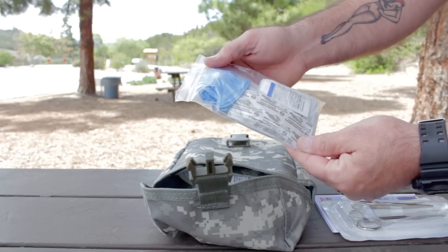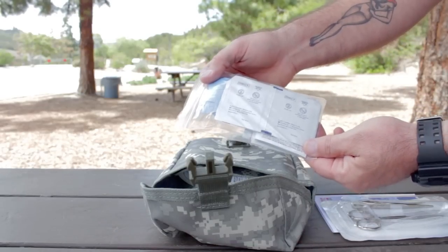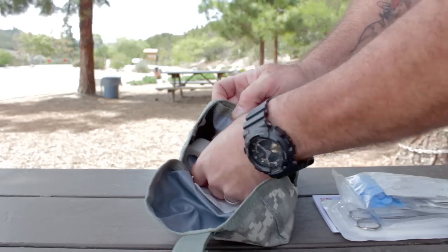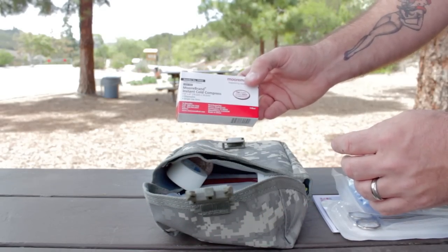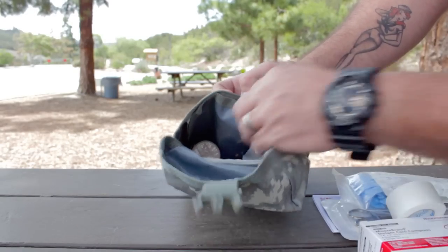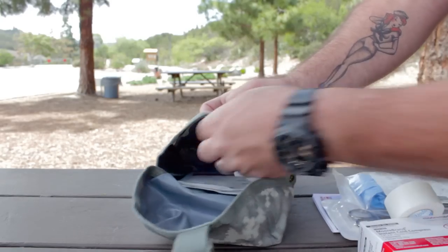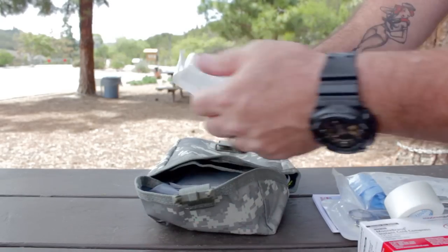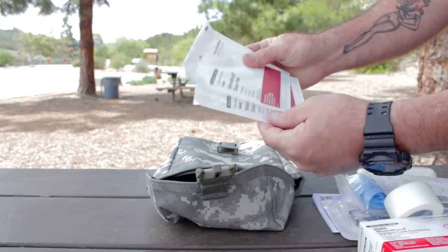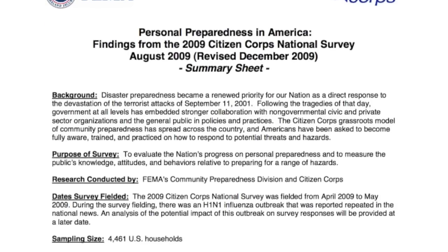There's also a bag with band-aids, antiseptic wipes, ointment, alcohol wipes, iodine, clean wipes, pain reliever, exam gloves, burn gel, and lip treatment. Next is a cold compress, then there's first aid tape, also an elastic bandage for strains and sprains, a roll of gauze, and some gauze pads.